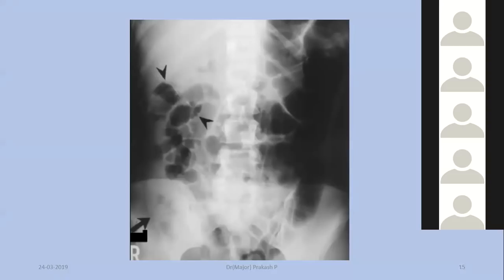People have attempted, but I am not very happy with those responses. It is not a regular sign, it is not a large bowel. I just wanted you to observe it fully. Since the case, as many of you have diagnosed, is something related to a rotation of the gut, kindly see that the small bowel loops are on the right hand side and the large bowel loops are on the left hand side. So on a plain radiograph, if you find that this is the kind of picture, always think there is something to do with rotation.